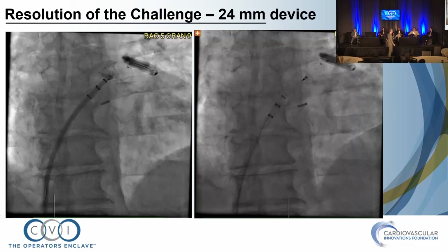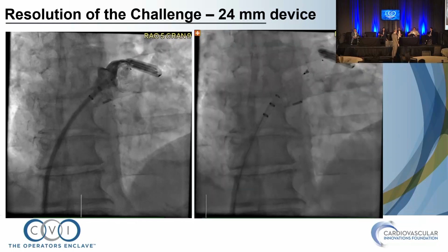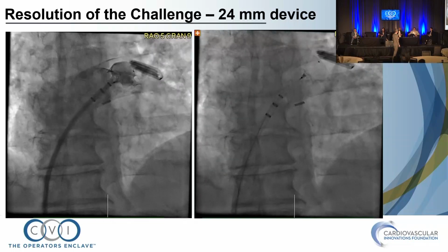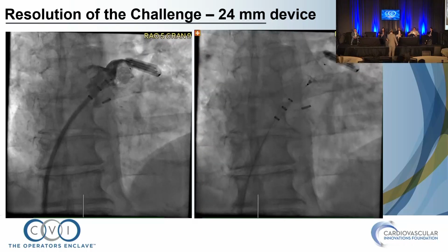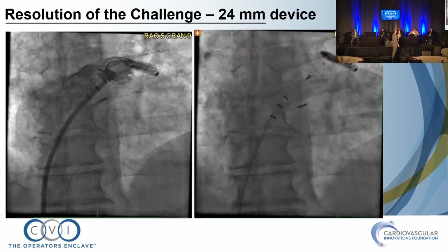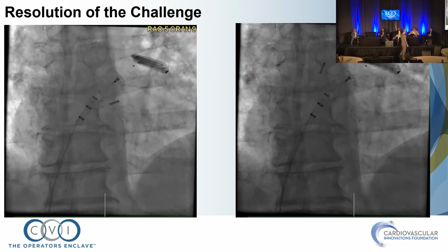We downsized it, and I had given this patient so much contrast. I thought that there was a better dye shot that I had. I certainly did a lot of tug tests. That device does not look compressed. It looks like it came out of the box. So we need a solution out of the box. And we tugged it some more, and tugged it even more.